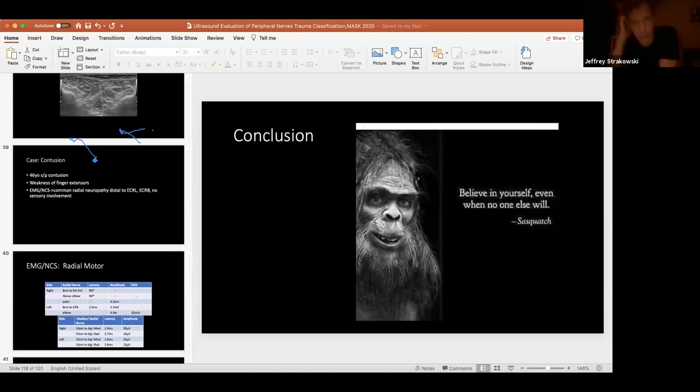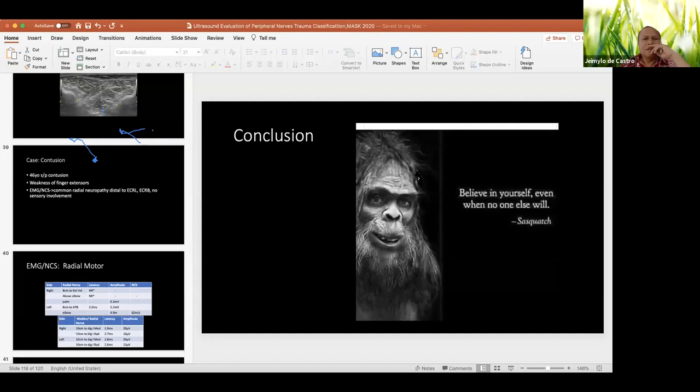For example, you can see some things in electrophysiology immediately, like recruitment changes. What you don't see is changes related to Wallerian degeneration. So if you're using prognostication and looking at the distal sensory nerve action potentials, the distal compound muscle action potentials, and fibrillations, those may not happen yet because the cell membranes of the muscle cells haven't degenerated yet. As long as you know those things, you can still gain information immediately with EMG. We do that all the time in trauma, but ultrasound's even quicker.